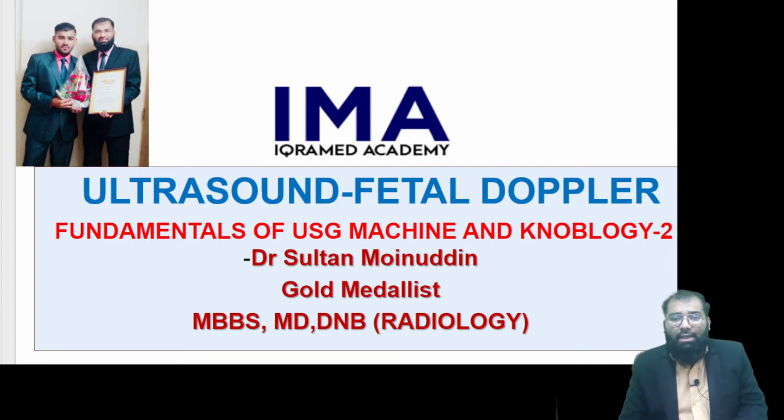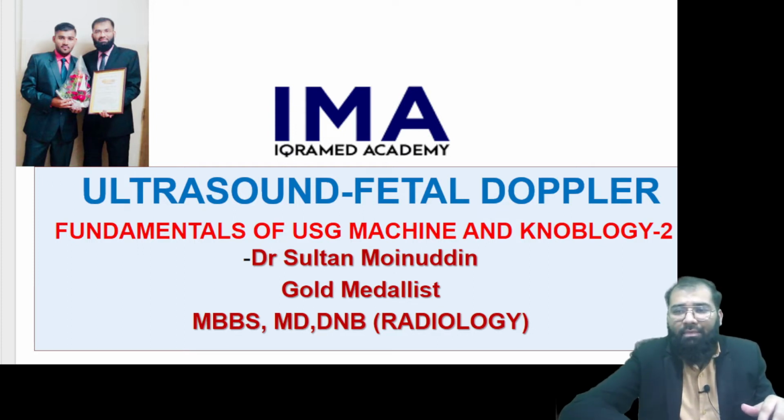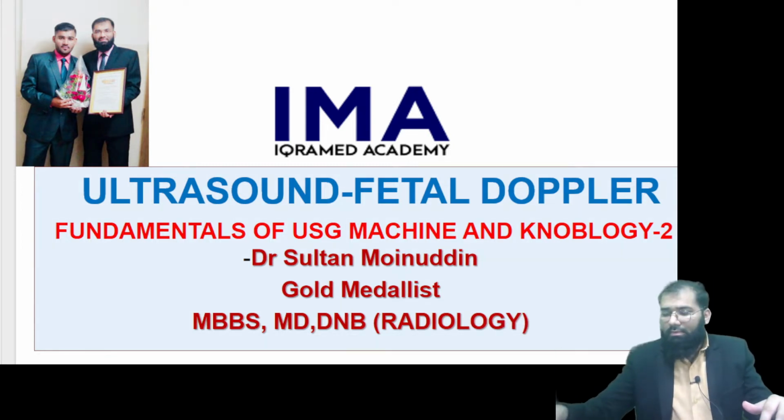Now in my session 1, I started from very basics, that is there is a very important knob to start the machine. Then I also discussed the second important thing: once after placing the patient on your ultrasound table, the most important thing you need to do is take the right preset and the right probe.